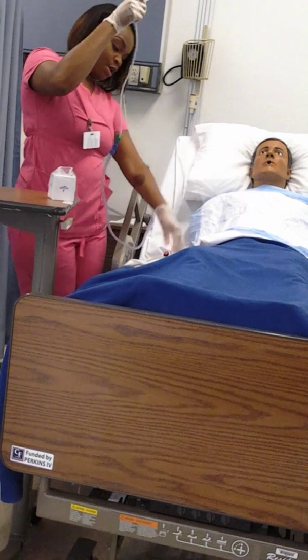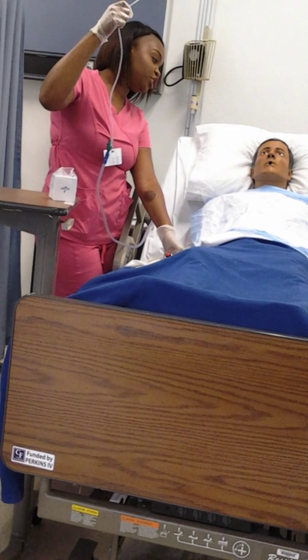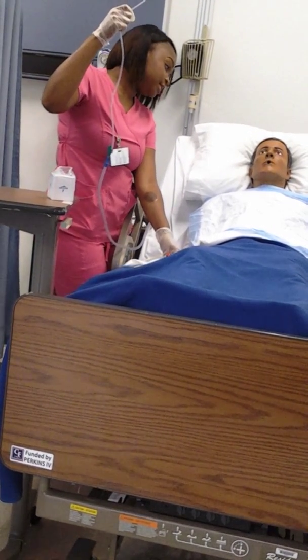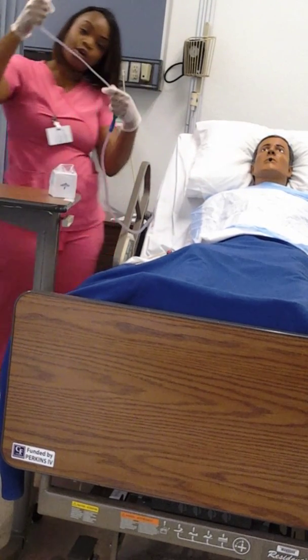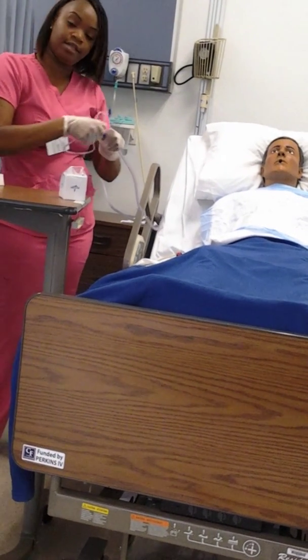Still sterile. Go ahead and check the pulse with my non-dominant hand. Make sure she's doing okay. Are you doing okay? Yes. Okay. So we're only going to go in that one time. Got a good amount of secretions. Go ahead and turn the equipment off. Disconnect the catheter.